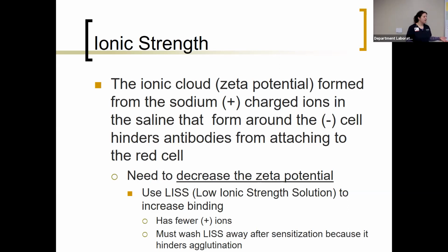Why? Albumin is a protein. Excess protein can cause false positives. Okay, so while protein might have been used as an enhancement media a long time ago, it's not really very common now, and our blood bank reagents have improved in manufacturing process as well.